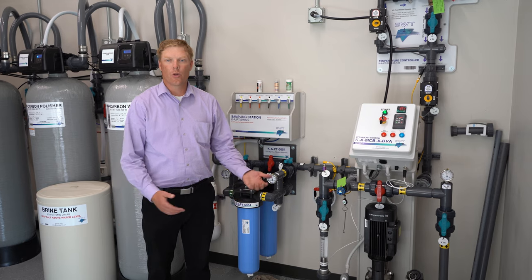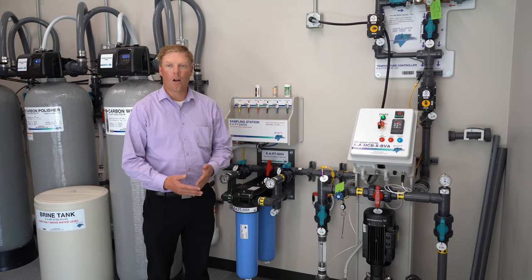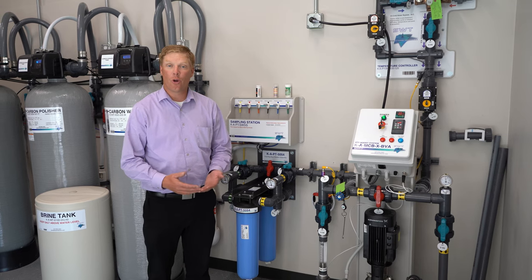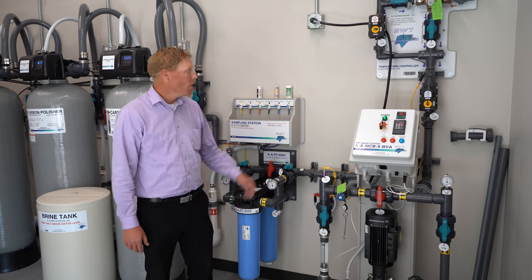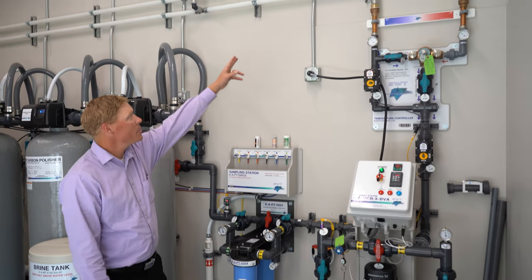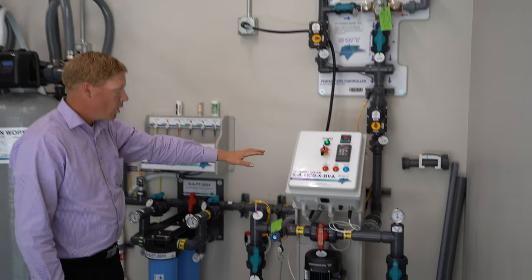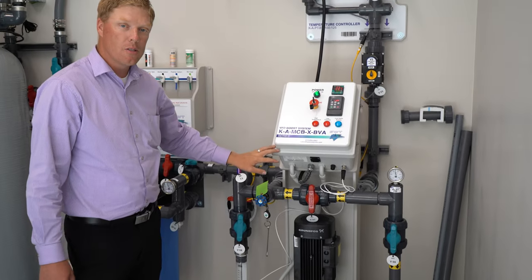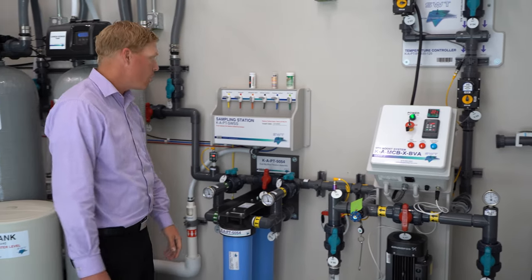The water system cleans the patients' blood — we have to have pure water. The water that comes out of the tap is not pure, so we have a system here to clean it. As you can see up here on the white pipes, that's where the water first comes in. It goes into this booster pump, which provides the pressure needed to go through the RO system.